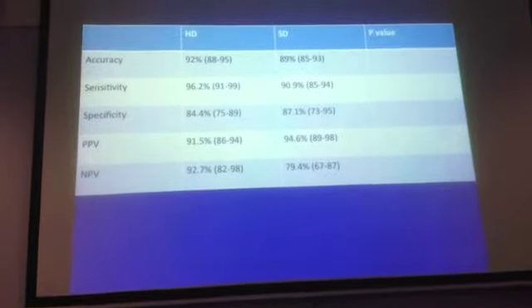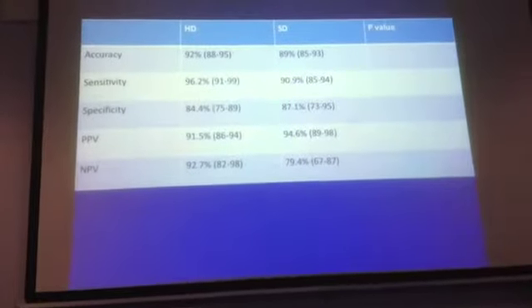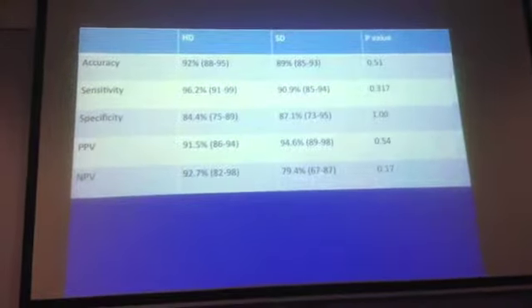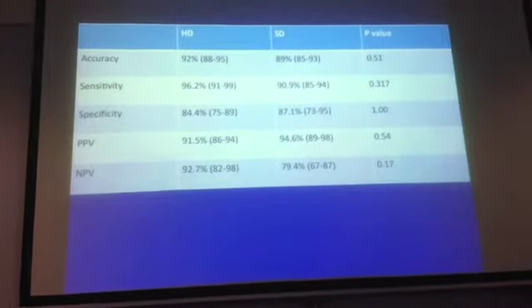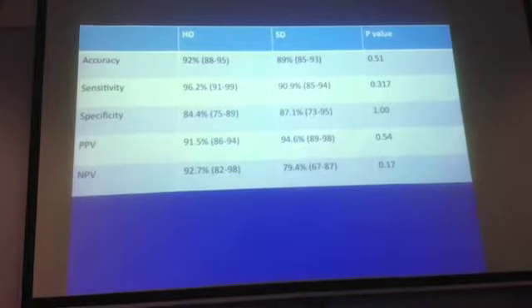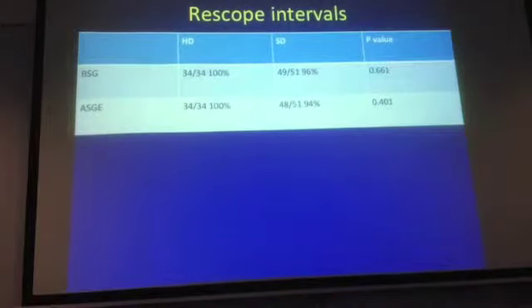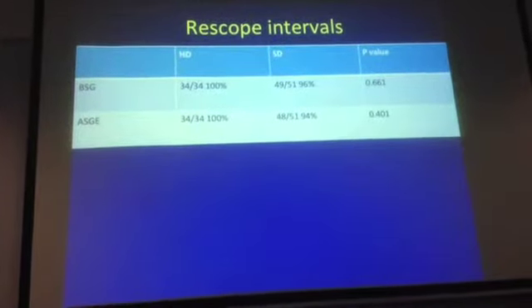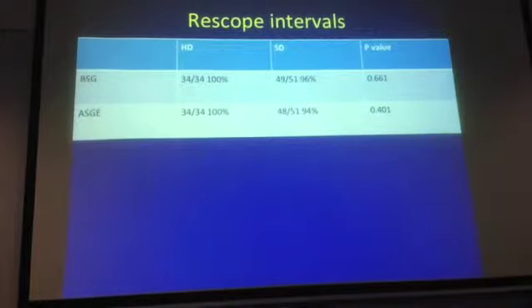What is interesting to note though is you get very good results with standard resolution endoscopes. If we look at the p-values, there is no statistically significant difference whether you're using a high resolution scope or a standard resolution scope if you're using indigo carmine dye. This translates into the rescope intervals, another key PIVI standard. And we can see that you can set the rescope intervals very accurately whether you're using an old endoscope or a newer endoscope.